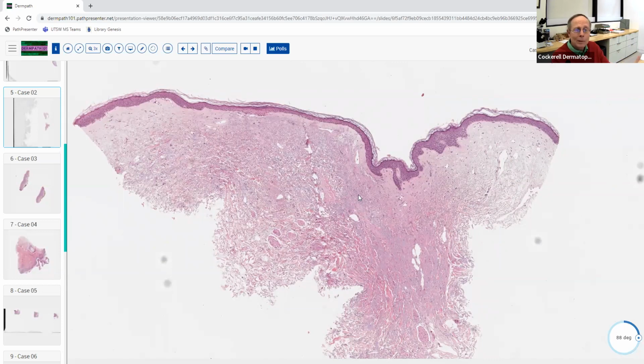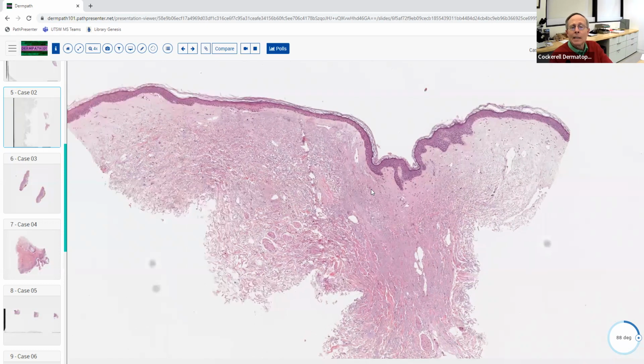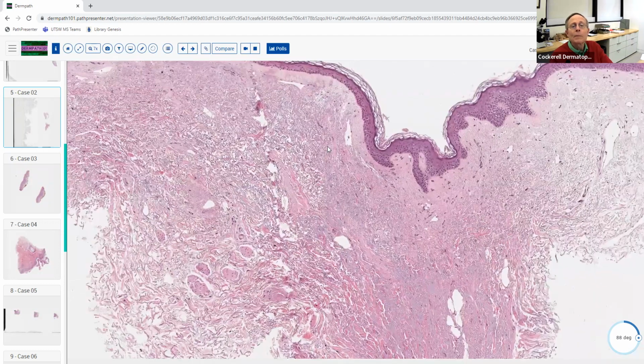If it's inflammatory, it's going to be just a very sparse superficial perivascular dermatitis. And when you get into that category, unfortunately, there's probably about 30 or 40 things that can cause that. And you have to sort of think about it. But there's one other of the 9 patterns that sometimes kind of gets forgotten about a little bit. And you kind of have to think about that also.